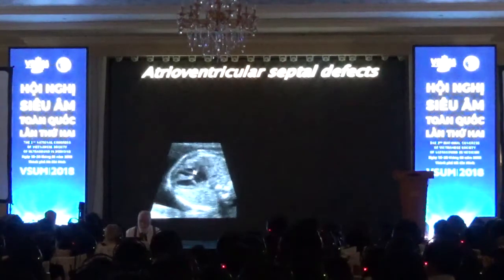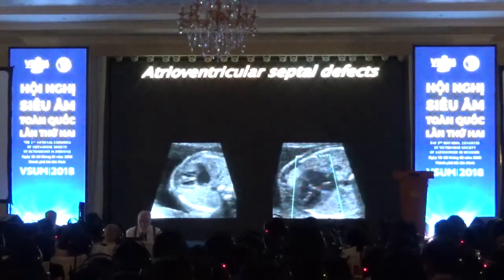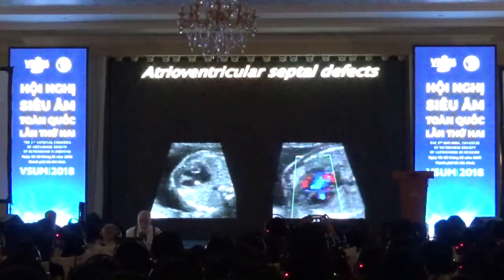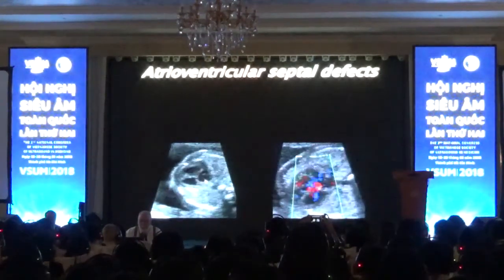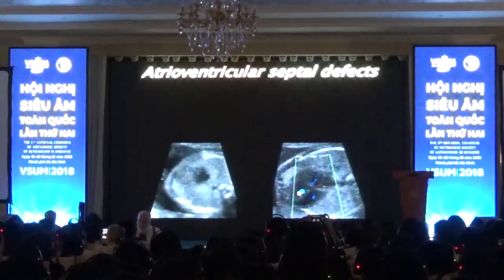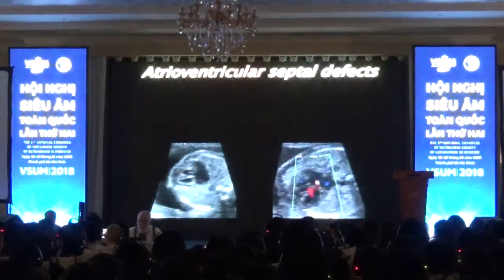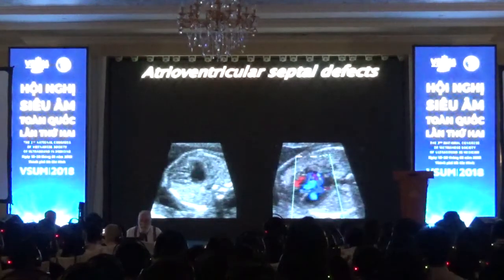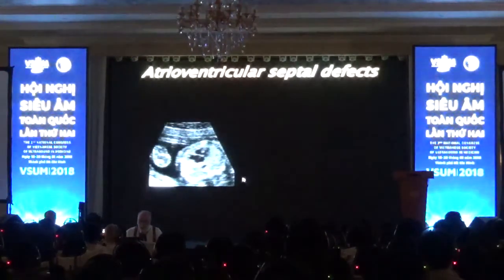Another example, you can see this big bridging valve. You can see still part of the foramen ovale flap, where you almost don't see the interatrial septum anymore. And you can see during diastole with color Doppler that blood is going into both ventricles at the same time. So that makes the diagnosis quite easy.